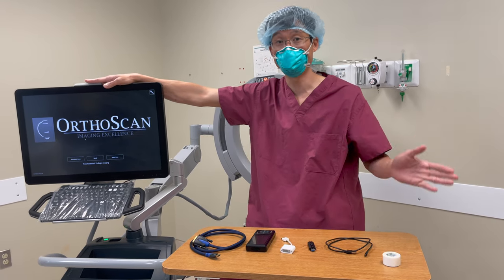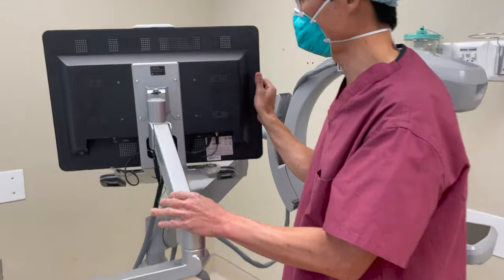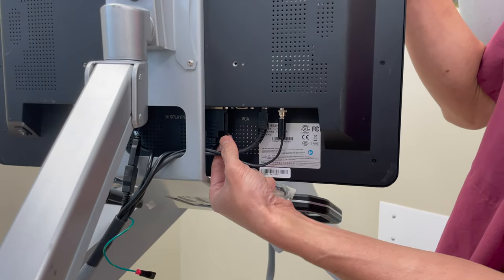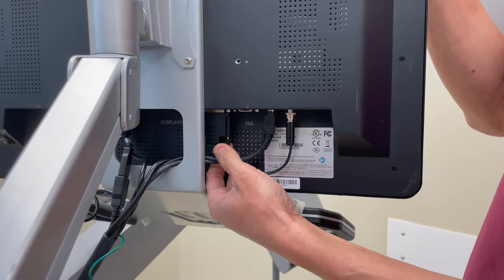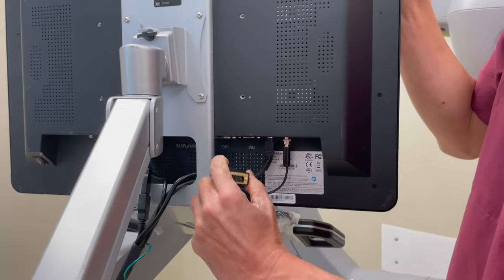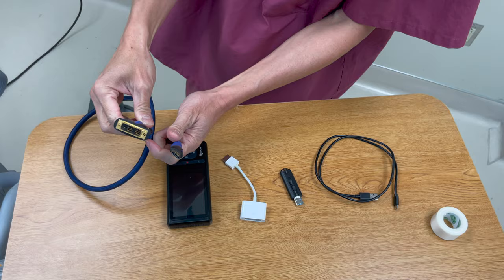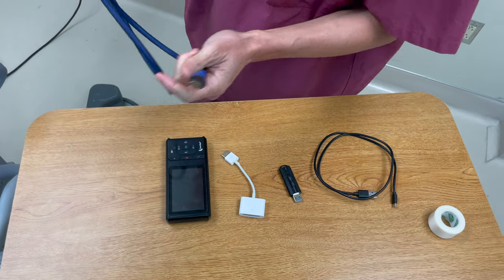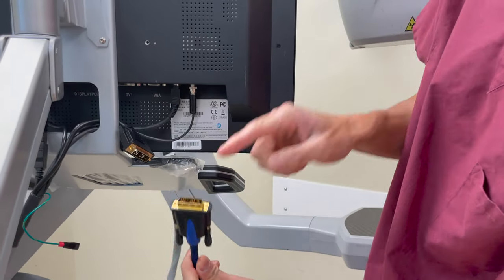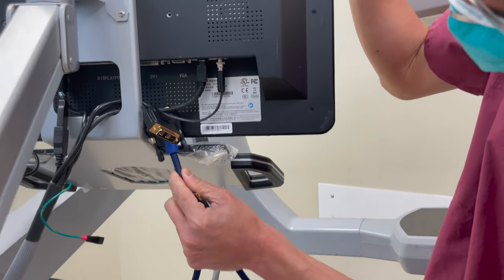The way you do that is you put this machine around and look for the DVI cable right here, then you remove the DVI connection and save that cable for later. Then you connect your DVI to HDMI converter to this port here.